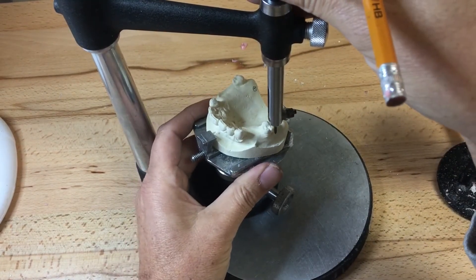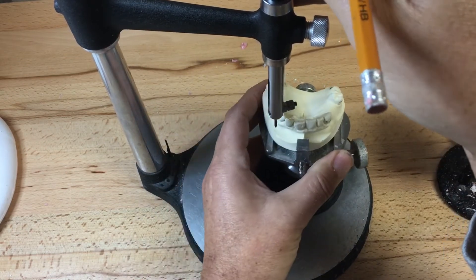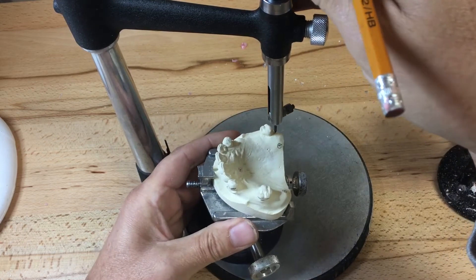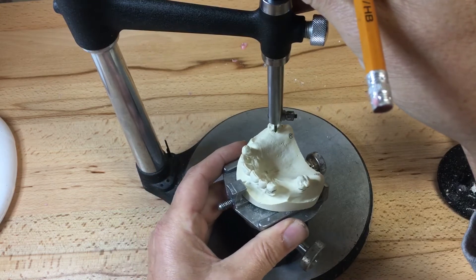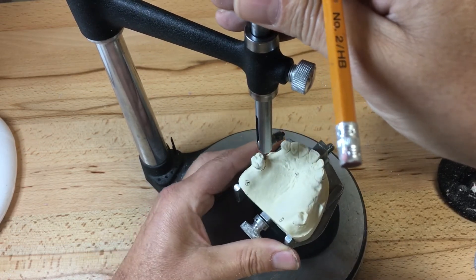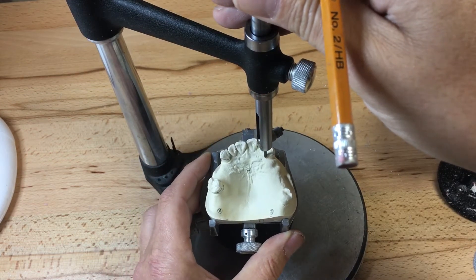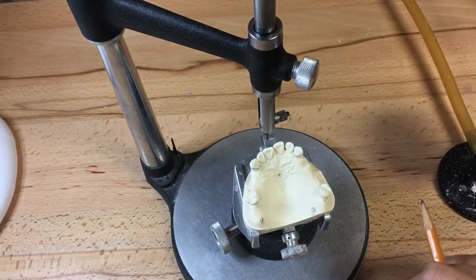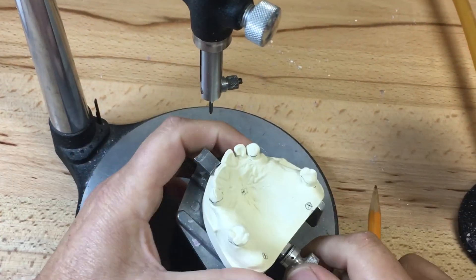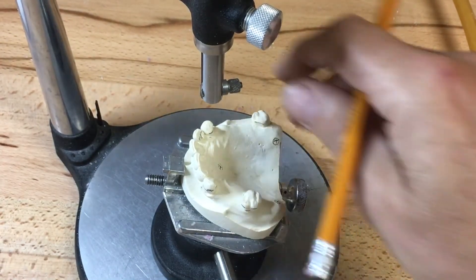Now I'm going to describe the heights of contour of all the abutment teeth, starting with 1-6, 1-3, and 2-3 — these are the labial buccal surfaces. Heights of contour are a little bit high on the molars, and then conversely on the lingual side if there are any. It looks like we might have some on the anterior canine, so our aprons must cover this undercut.